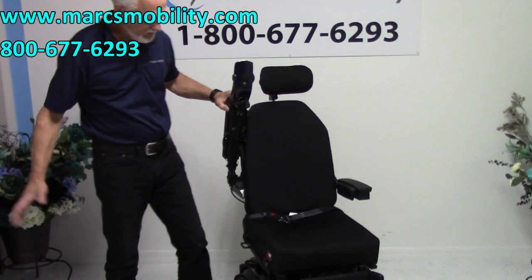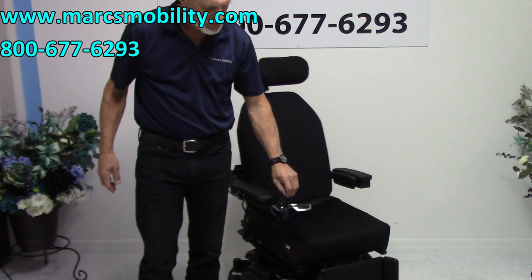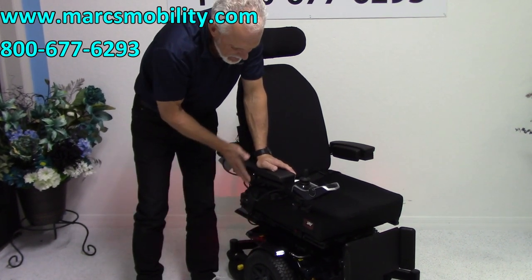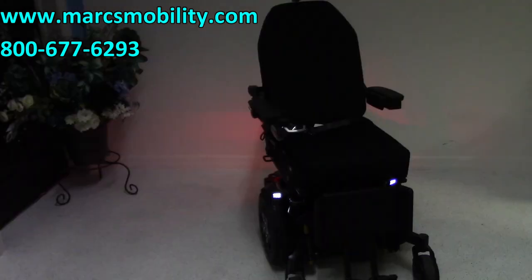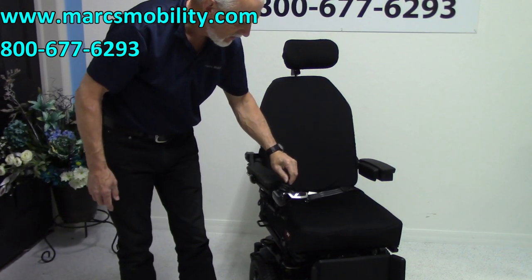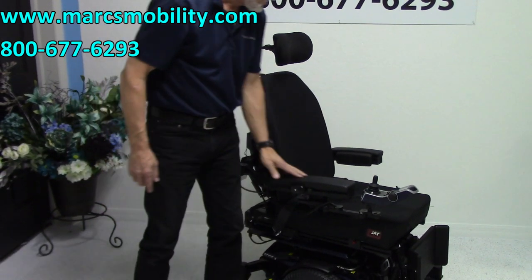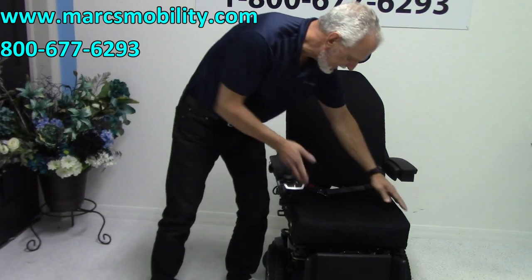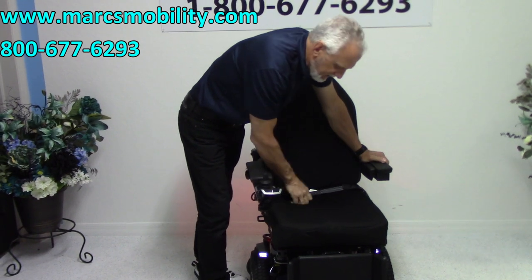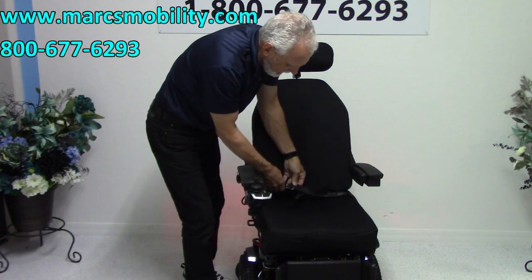The arms on this chair do flip up, so if you transfer from the side, you just flip the arms up. We do have lights on this chair — the light button is right here, but I'm going to move it under here, because there, as soon as you bump it, the light comes on. You can see the headlights and the lights on the wall. It does have the light kit, which is nice. It also has a safety belt. We have a nice 18 by 20 cushion — 18 wide, 20 deep. This is foam on top, but all the inside feels like pudding — it's gel. The whole bottom back of the cushion is gel.